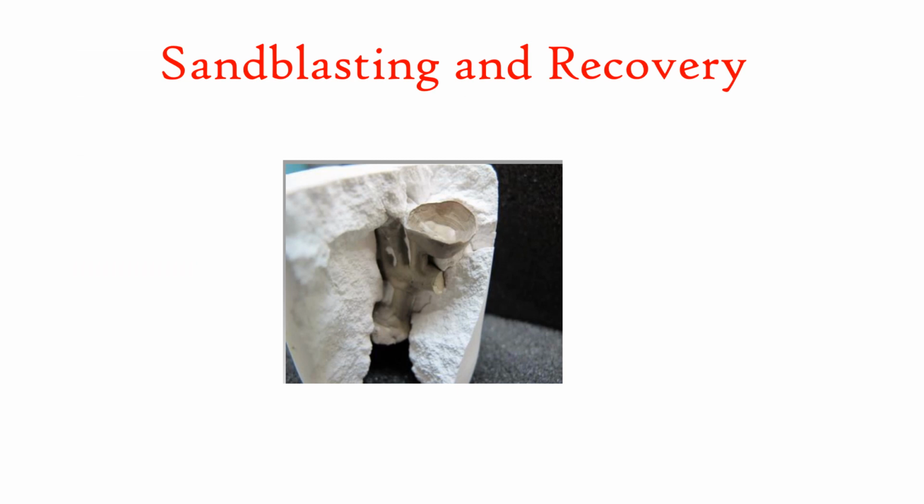Now the one step which is left is, after your ring is cooled for 10 minutes, if you are using gold restorations, if you're making a gold casting, then you have to do one step which is known as quenching. Quenching is placing the heated casting ring inside water for a few minutes, so that the investment material will break. But if you're using base metal alloys, then this quenching step is eliminated. Only if you're making a gold casting, you have to do quenching.